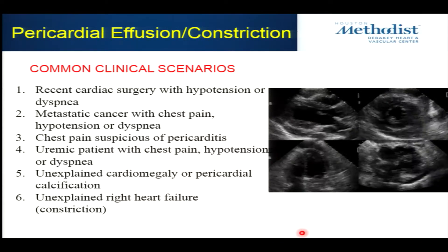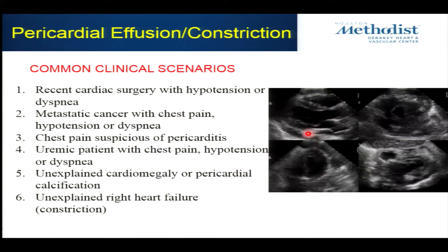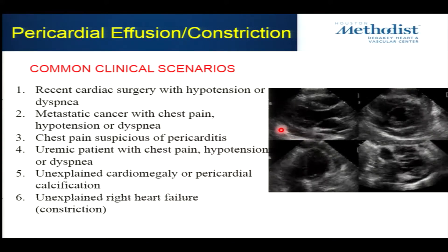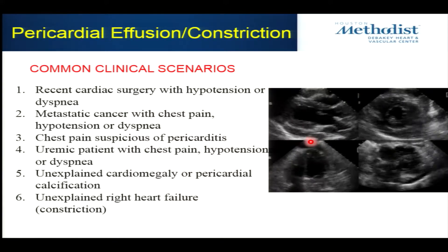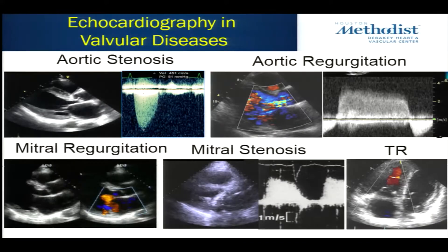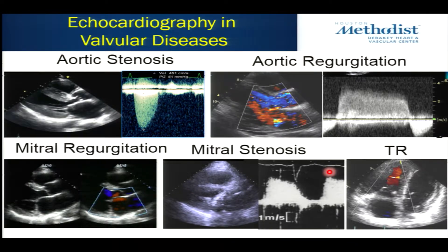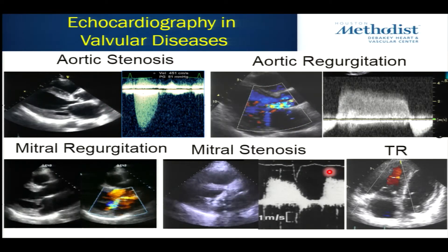Pericardial disease is very important. This is a constrictive effusive pericarditis on this patient. You can see where the pericardial fluid is — anteriorly as well as posteriorly — and I think this is very important going forward in patients that you're suspecting pericarditis or constrictive pericarditis.